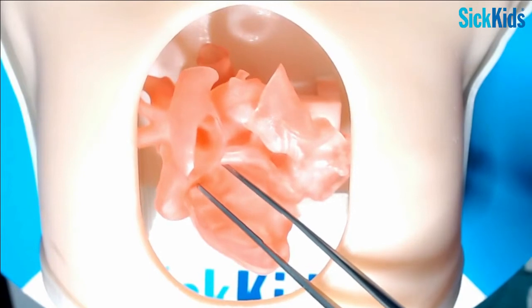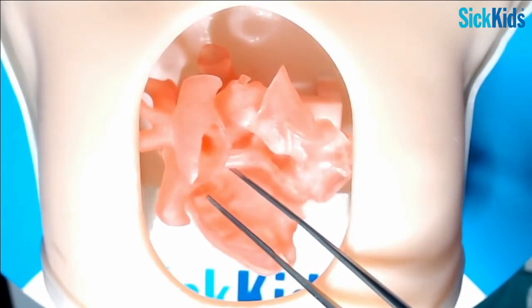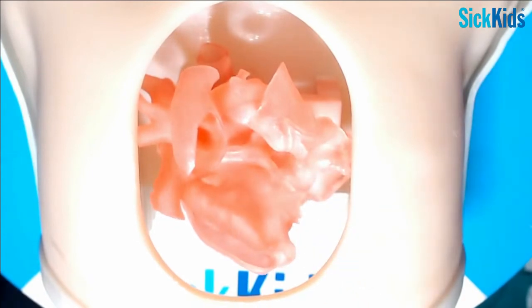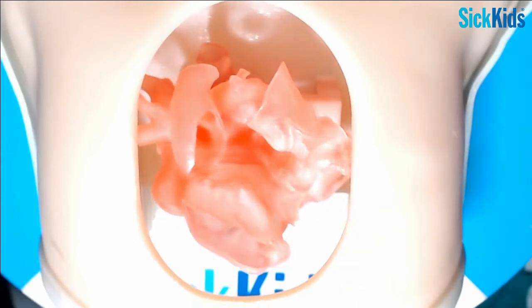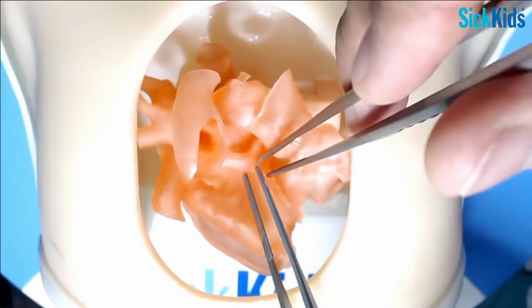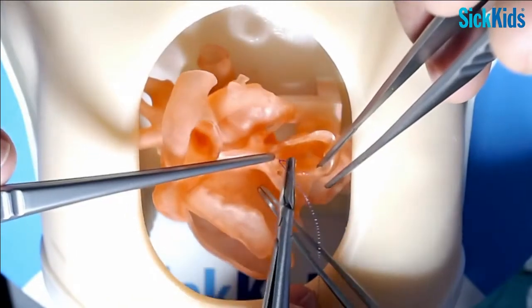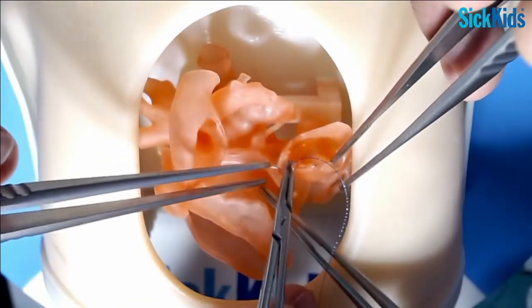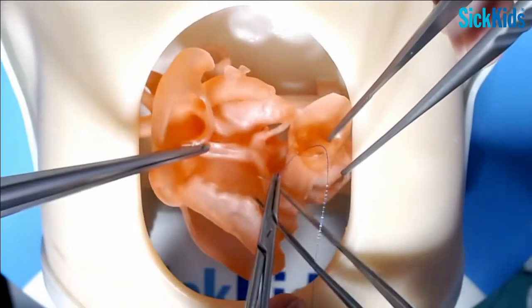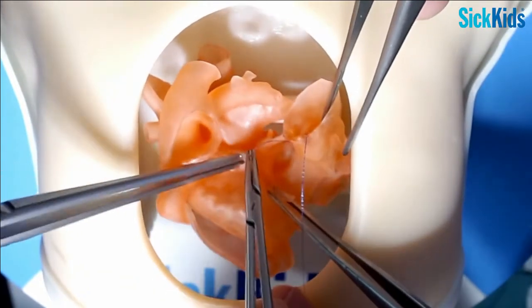And then we start sewing. So the first sewing that I do is to put the DKS together. And just start inside, right next to the apex. And then you can come inside and open it up with your pickups like this.